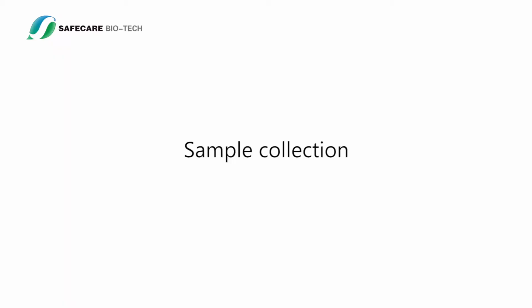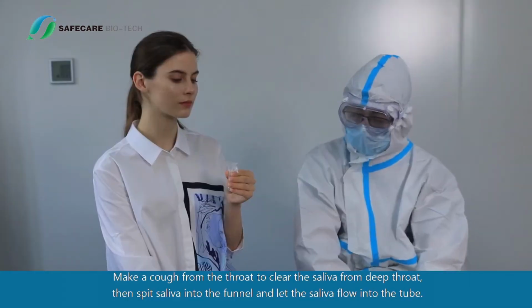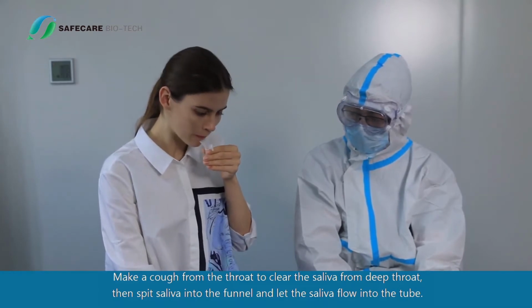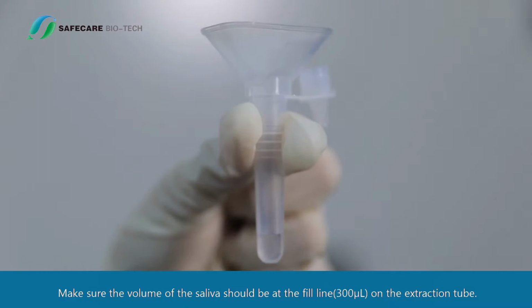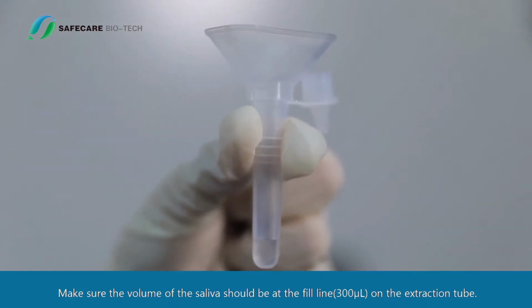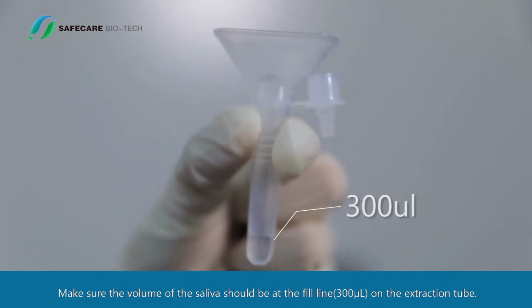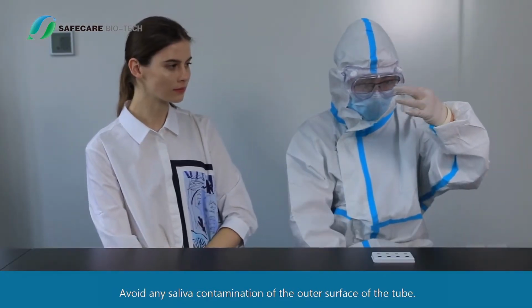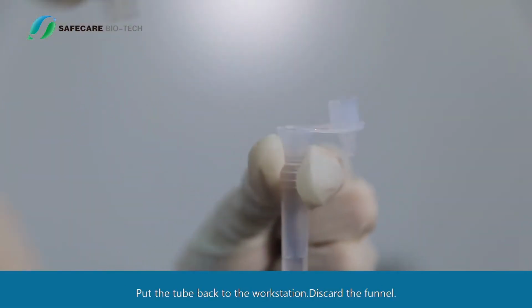Sample collection. Insert the funnel into the extraction tube. Make a cough from the throat to clear the saliva from deep throat. Then spit saliva into the funnel and let the saliva flow into the tube. Make sure the volume of the saliva is at the fill line, 300 microliters, on the extraction tube. Avoid any saliva contamination of the outer surface of the tube. Put the tube back to the workstation, discard the funnel.